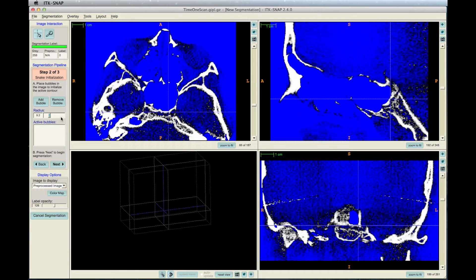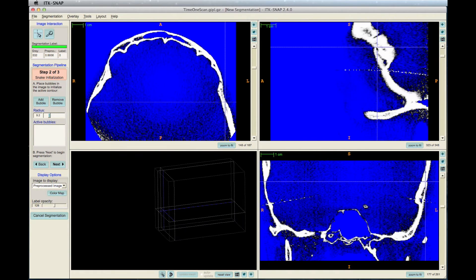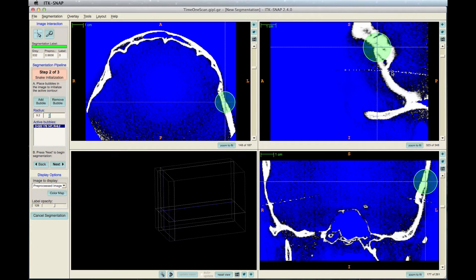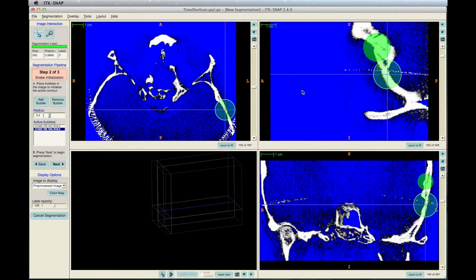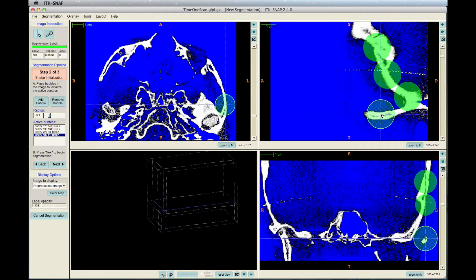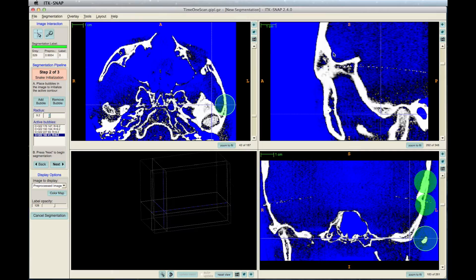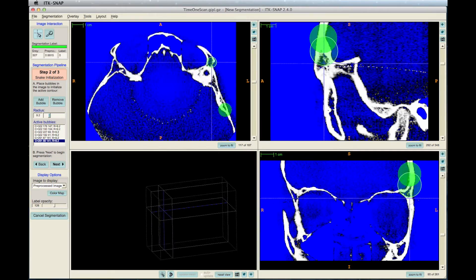You can take this moment to drag the bars in your window to obtain the different views and slices. The next step is to add bubbles to the scan. Click the Add Bubble icon on the left. Try to add bubbles at the bone, which is the white in the window. There is no problem with putting a bubble in the blue or black, because it will fall into the white bone in the next step.